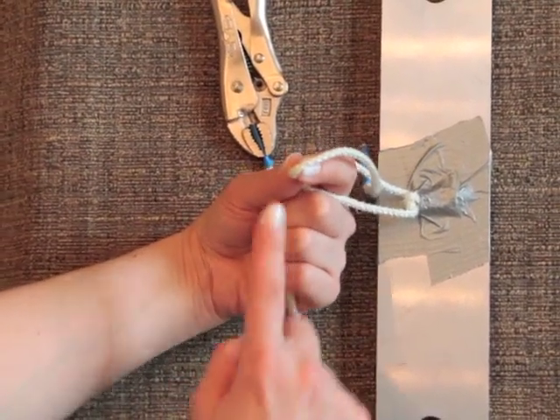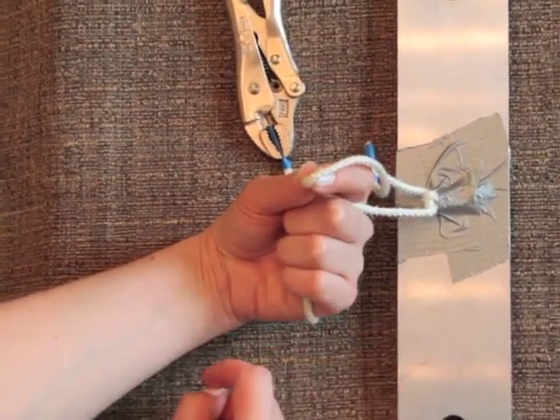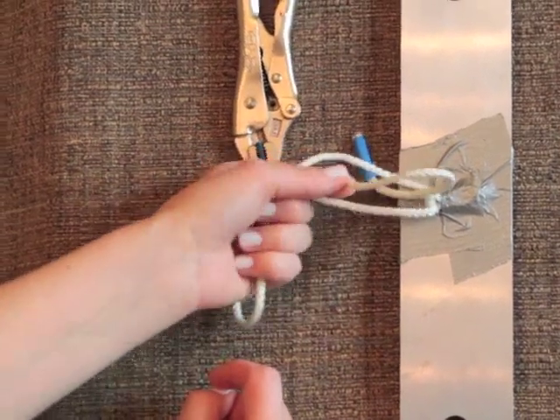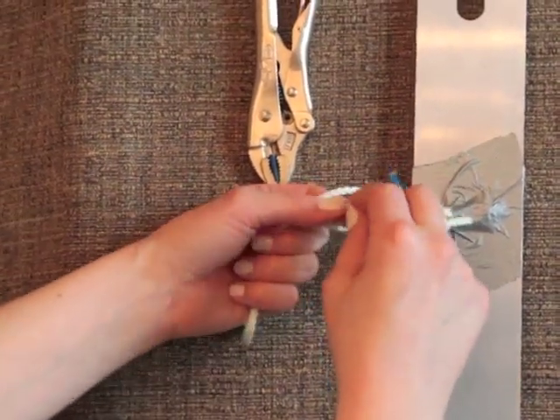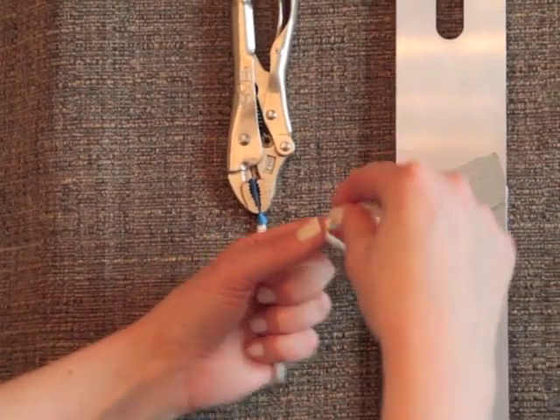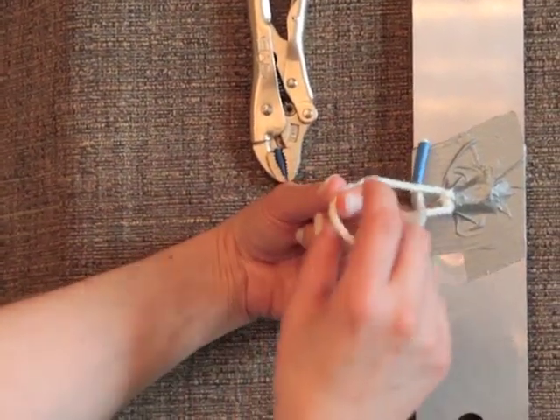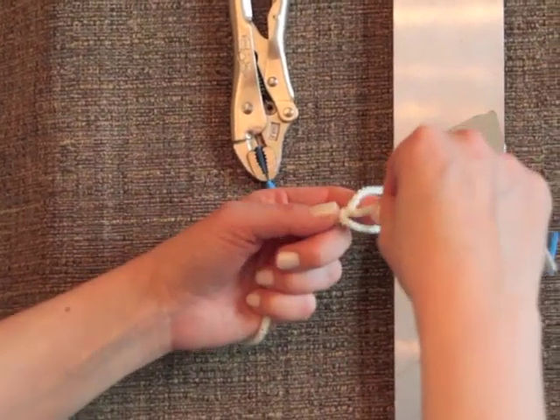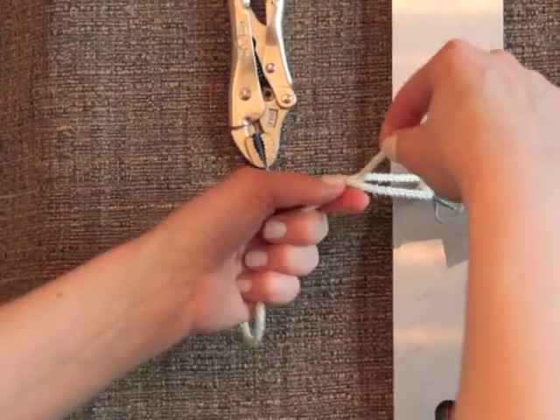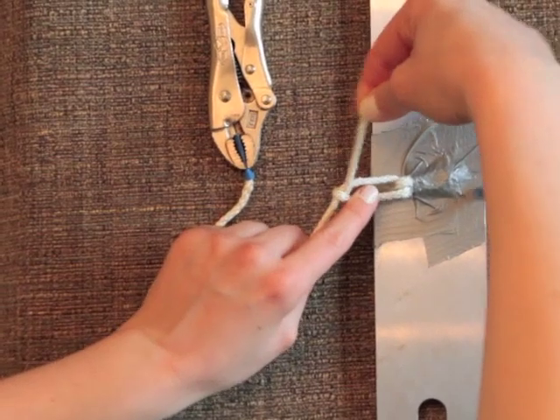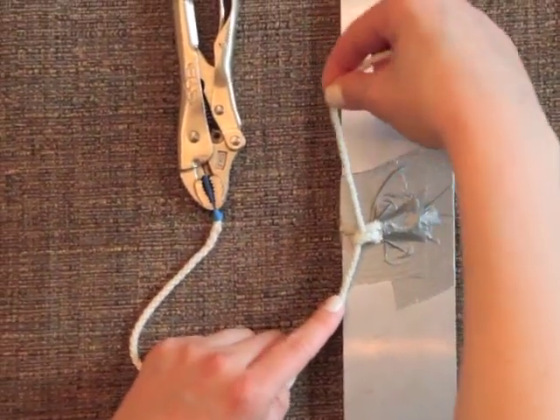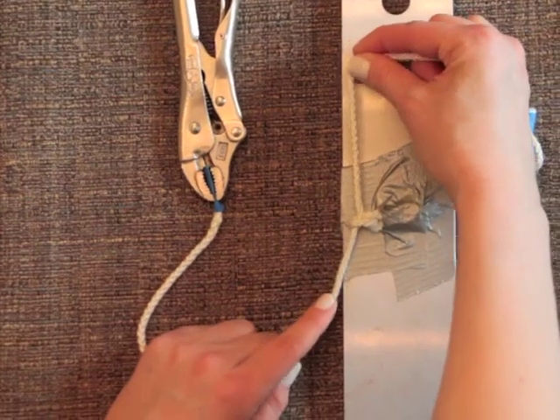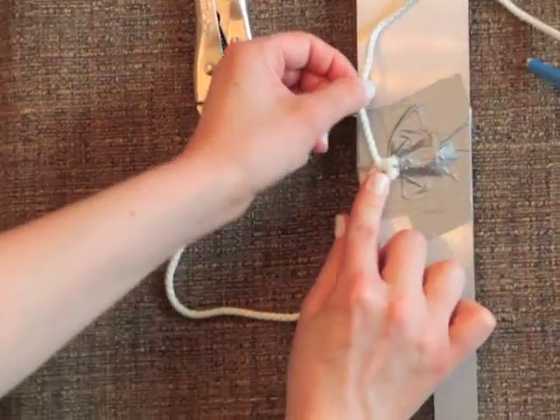And this really emphasizes that you're going to really pull through as much as you can. You don't want to just be here and possibly lose the end or not really be able to pull it through. You want to assist by pulling through as much as you can. And then your right hand is just right there to catch it. Now you're going to do the opposite way. Vertically again, falling through. But this time, my right hand is on top and my left hand on the bottom. And that's what's going to make that square knot.